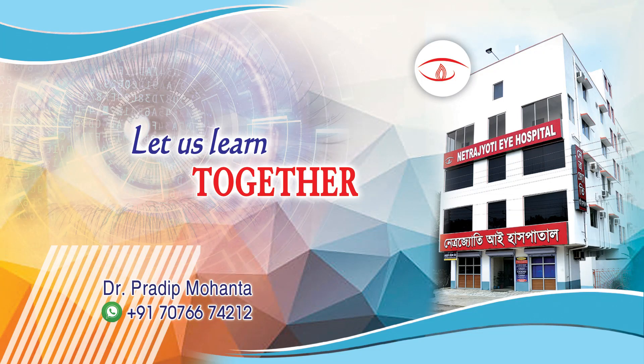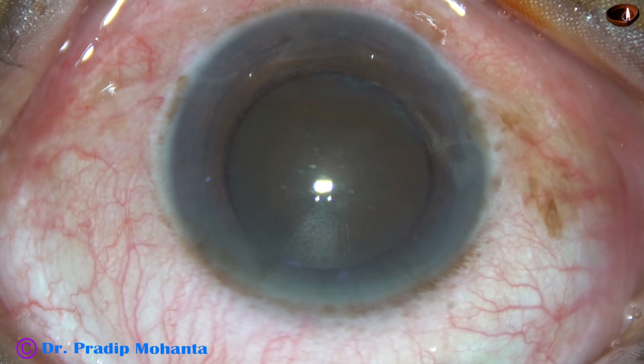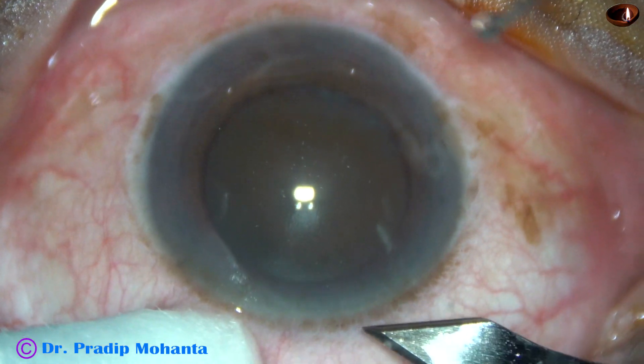Friends, welcome to my workplace at Ranaghat, West Bengal, India. This is a very hard cataract, a nucleus sclerosis about grade 5. Let us observe this surgery.